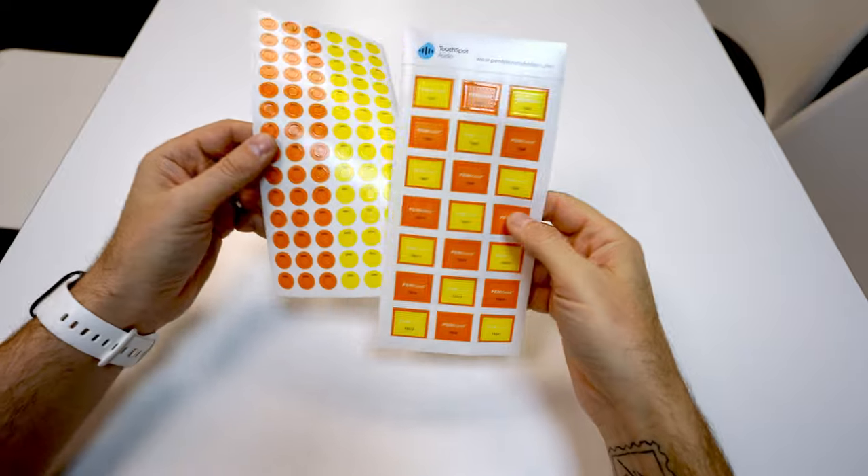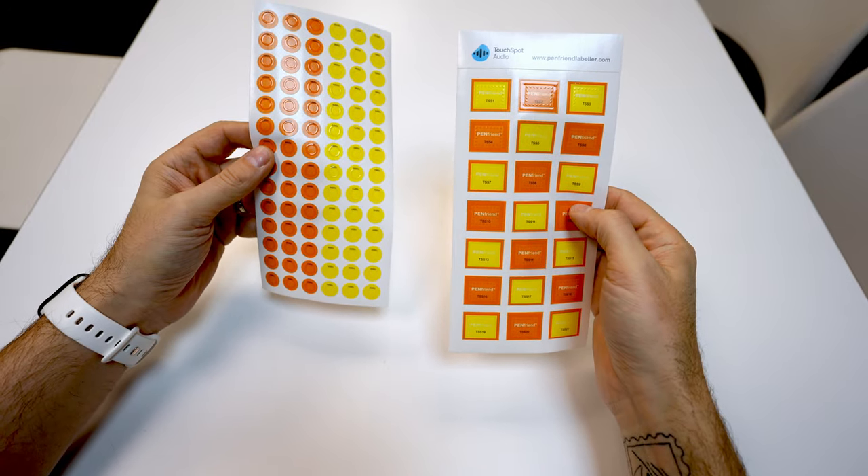So how does it work? In the package you get over 100 label stickers — an assortment of colored round stickers and some square and rectangle ones. If you need more, you can purchase packets of extra stickers. The way it works is extremely easy: you simply tap the tip of the Pen Friend to the sticker label, and the Pen Friend will automatically play the recorded message associated with that label. The recording time for each label is one hour, and the Pen Friend's internal storage holds up to 250 hours of recordings and media, including MP3s. That internal storage is also expandable with an SD card.